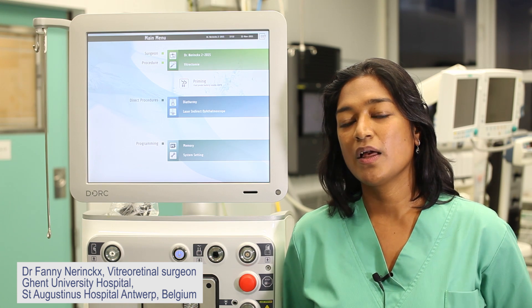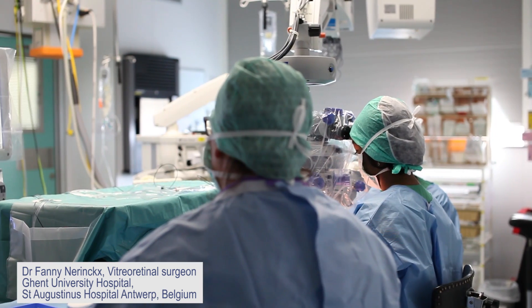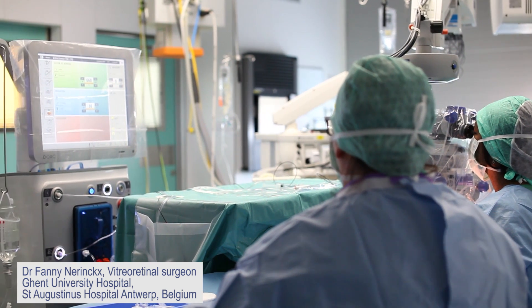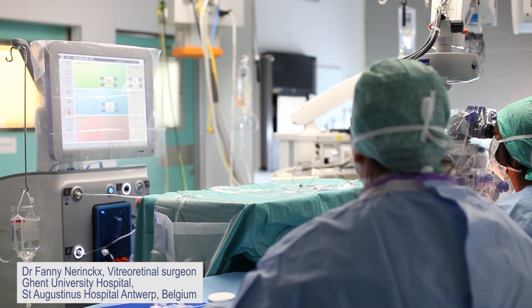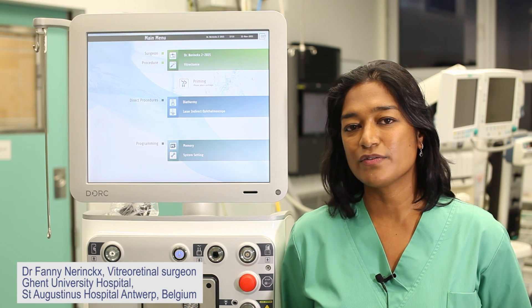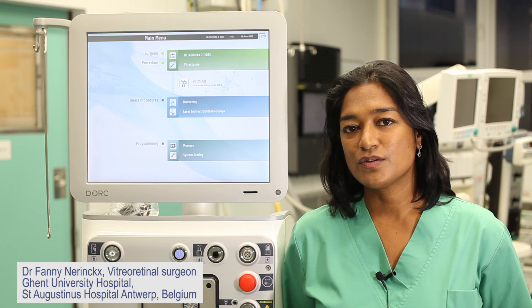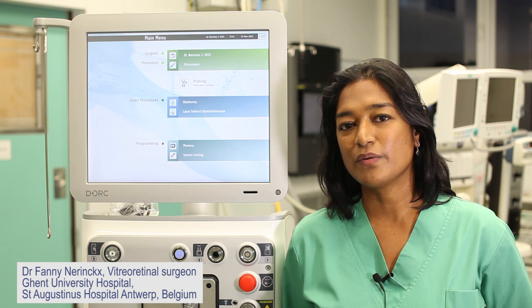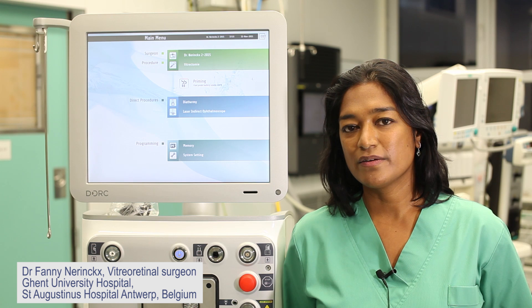For example, in a proliferative diabetic retinopathy case where you have a lot of blood, you can remove the blood very fast with vacuum mode and then switch to flow mode to remove the fibrovascular membranes. You can go very close to the retina in a very safe way.